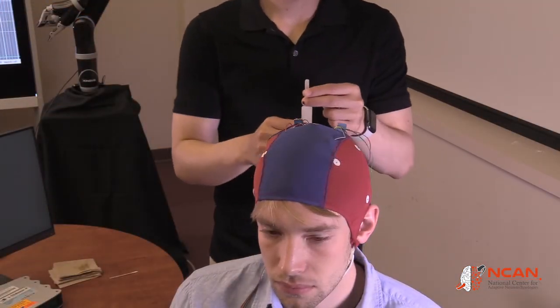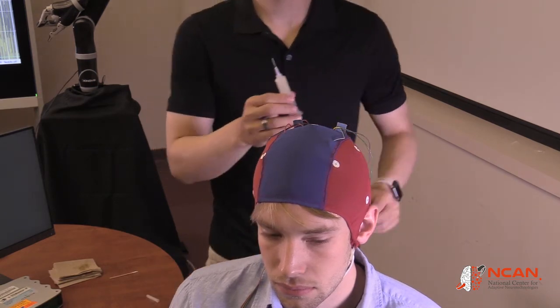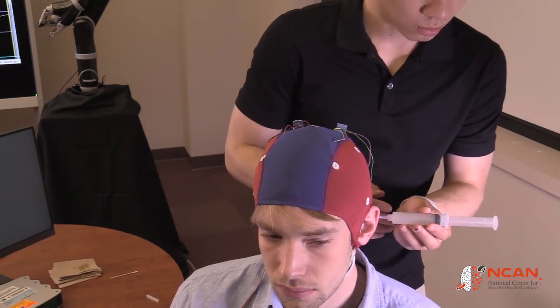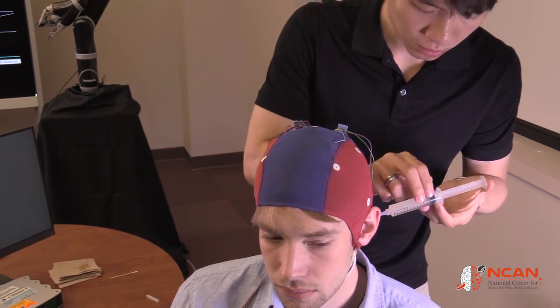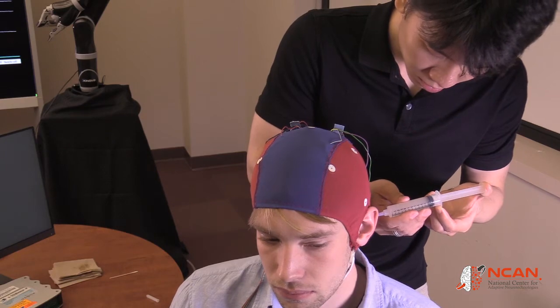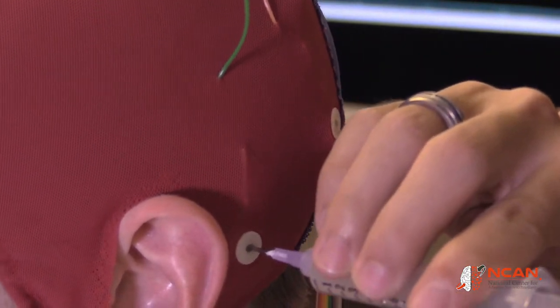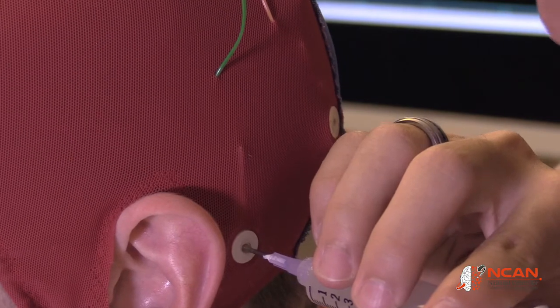After squeezing out air bubbles, we can carefully inject gel into the opening of each electrode. Only about 1 milliliter is needed to bridge a contact between the scalp and the electrode's recording contact. Also, be sure to apply gel at the appropriate ground and reference sites. The mastoid process behind the ear and the forehead are commonly used.